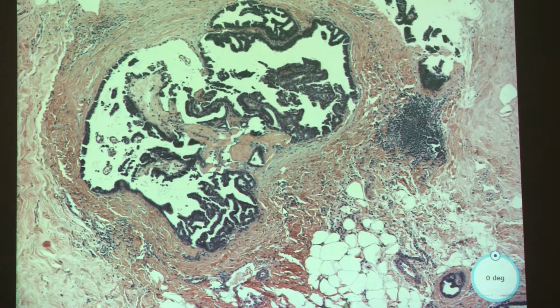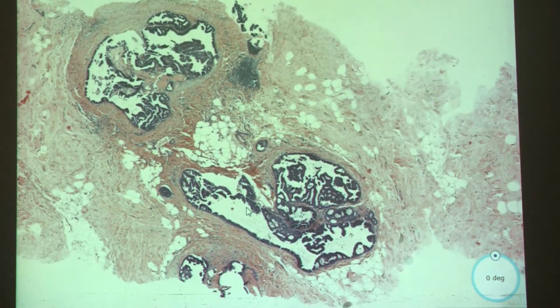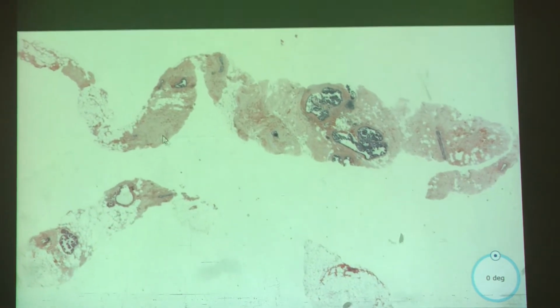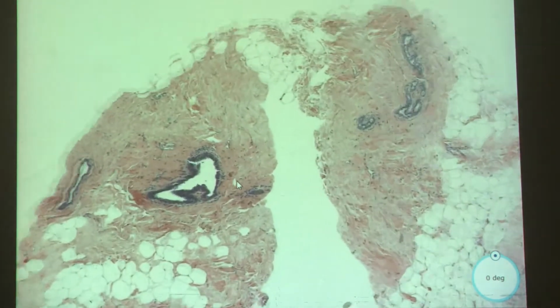But no, you would treat this like regular DCIS, because chances are, if they have DCIS involving a papilloma, there might be DCIS elsewhere in the breast, which may or may not show up, may not have a palpable mass, or maybe they did this because they had nipple discharge.